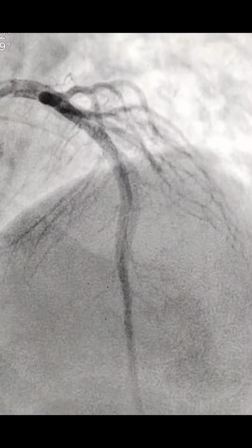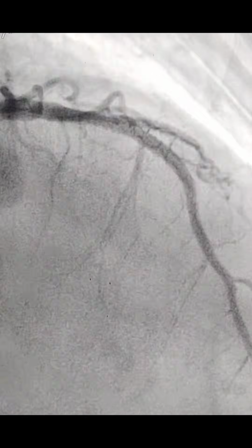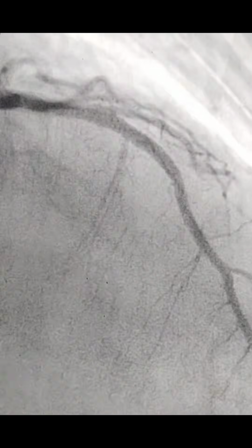There's the caudal view. There's a cranial view, and there was a TIMI 3 flow in the major and the second LAD. There's the RAO cranial view. So in this way, this is the angioplasty, a difficult angioplasty to the dual LAD system.